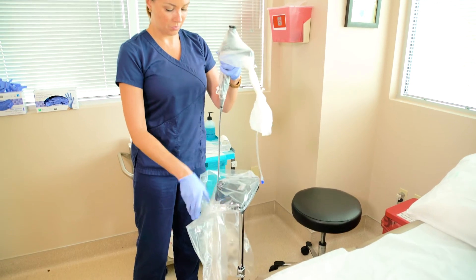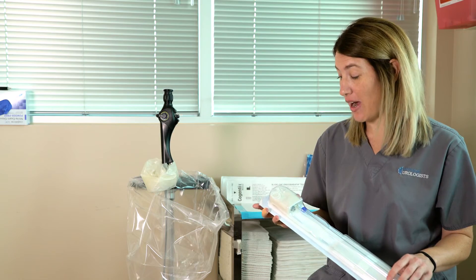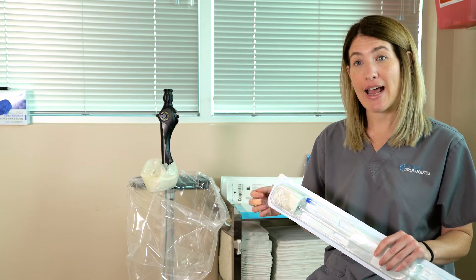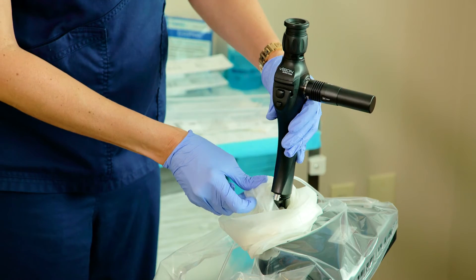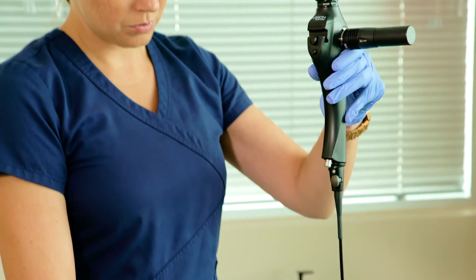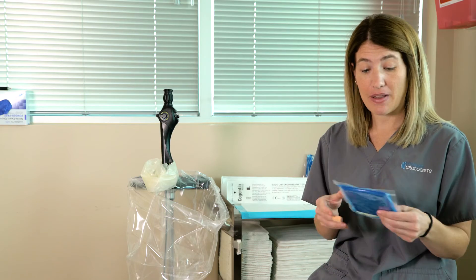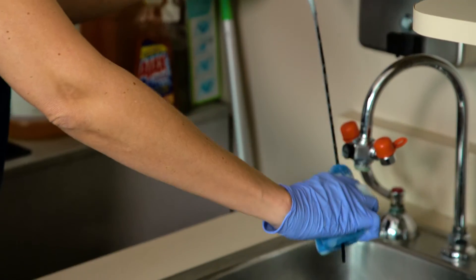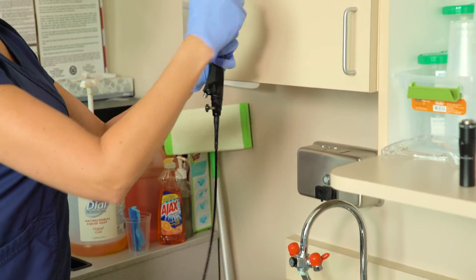This is the sterile sheath that it comes with. Every time you have a new patient you just open it up, load it onto the scope, and it's ready to go. Once you're done with the patient you just unload it by removing it from the scope. You wipe the scope down with the endowipe — it's an enzymatic wipe — and then clean it with alcohol after you flush it.